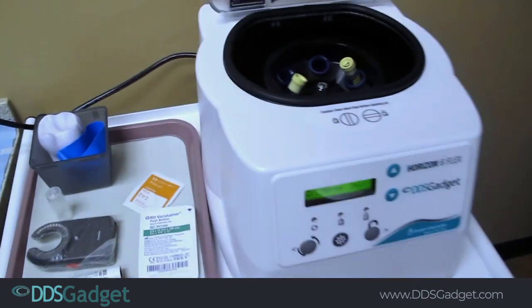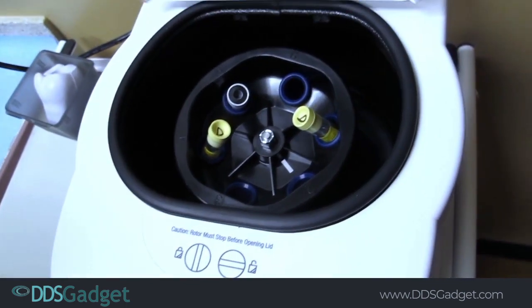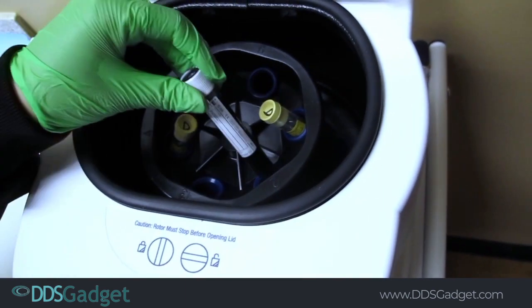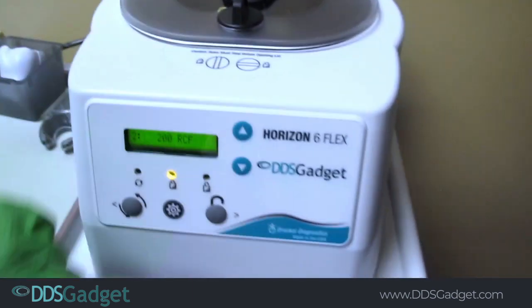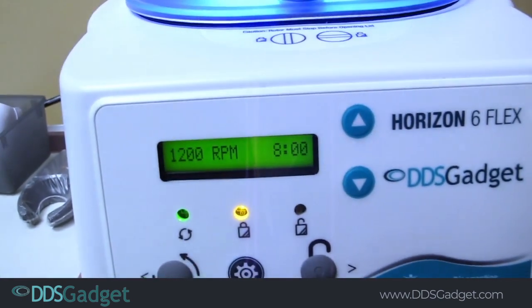There's our tubes right there — there's the first one, that's a white tube. I'll put the white one on the opposite side. Now she's going to hit the start button, which is the left button, and there it is.